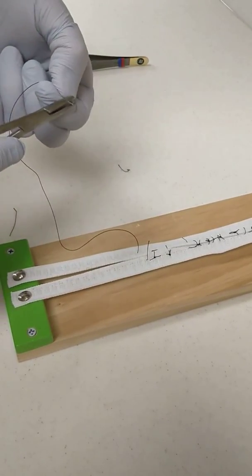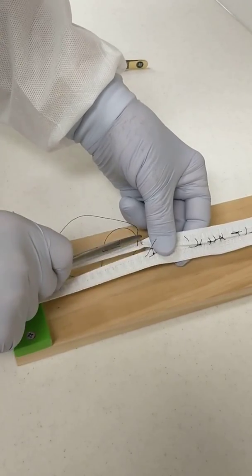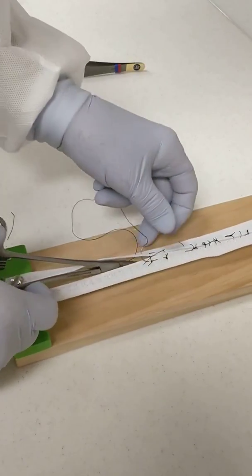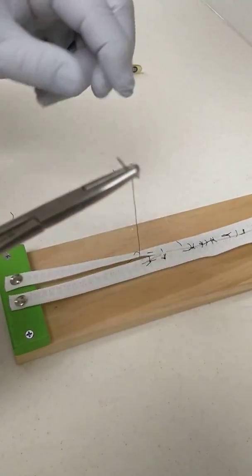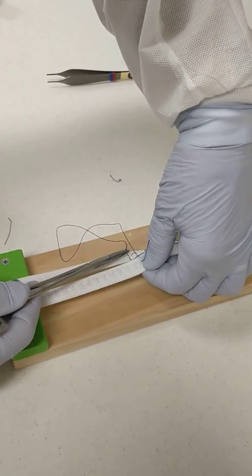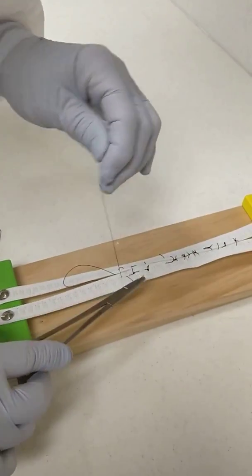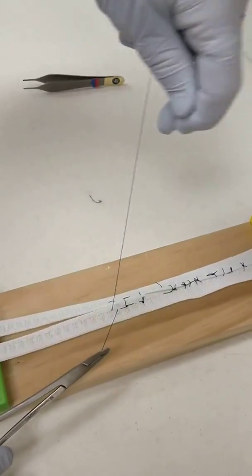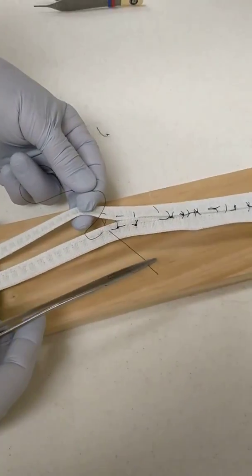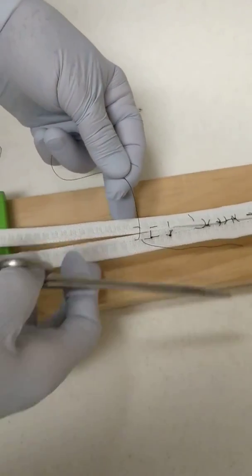And then we come back up. You can see where they loop over there. You don't pull this tight until you're ready.